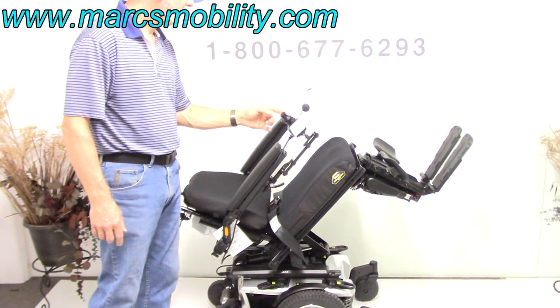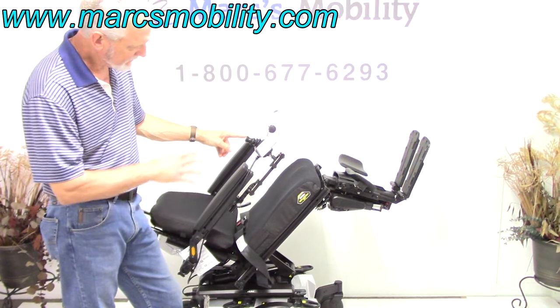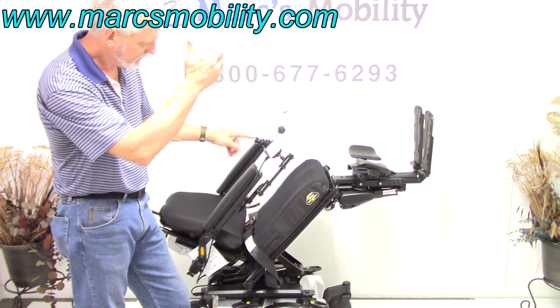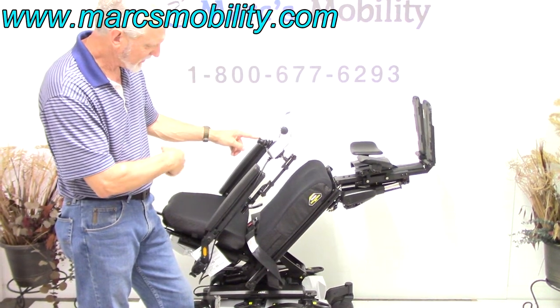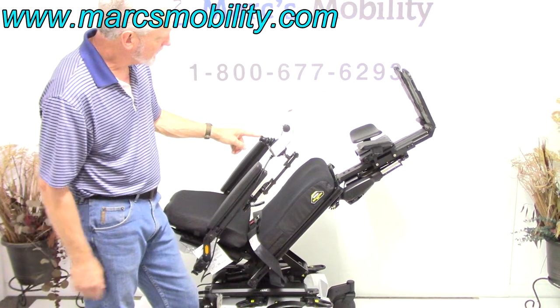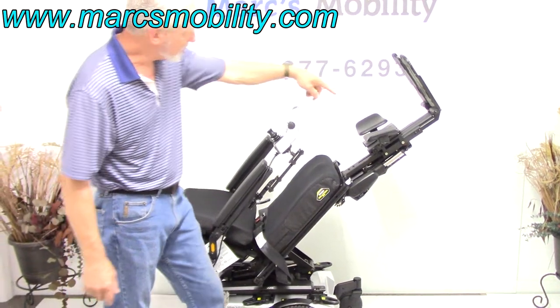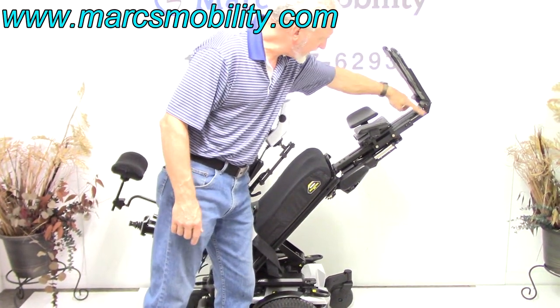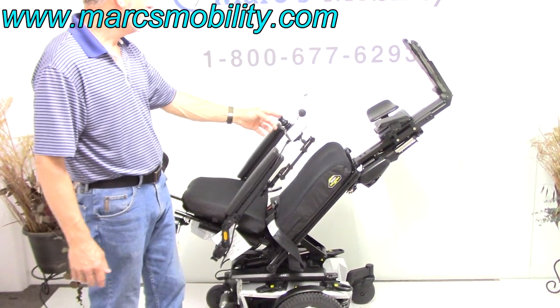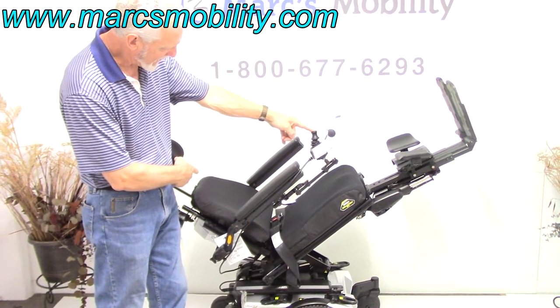The next thing we're going to show you are the electric legs. If you have a circulation problem and you want your legs higher than your body, you can do it this way. I want to show you how these legs go out — see they're going out now. These are adjustable; we can adjust the length of these legs depending on your height and weight and how you're using it.